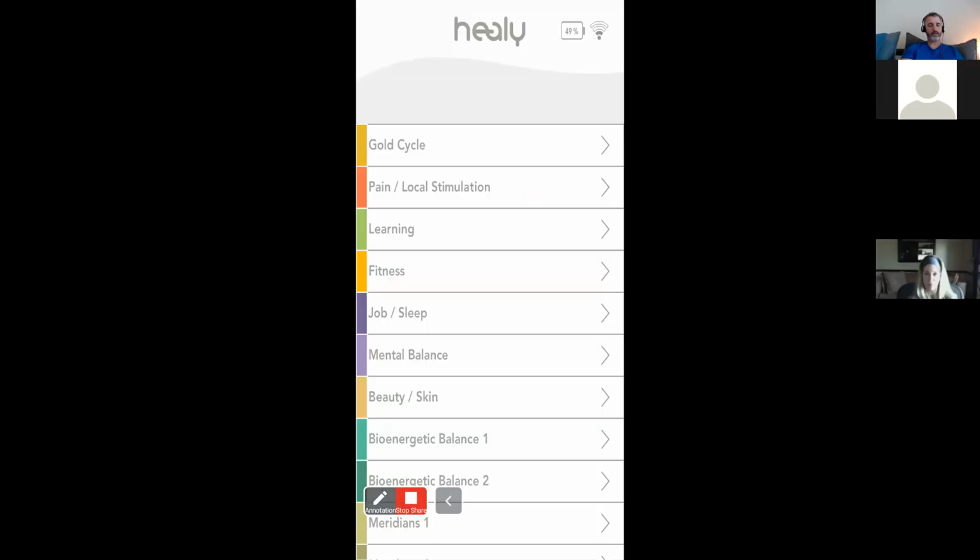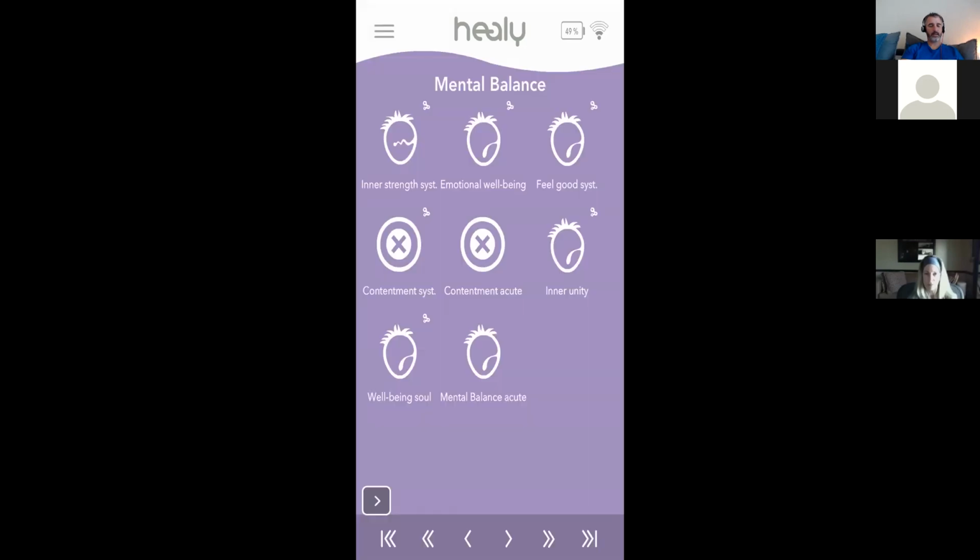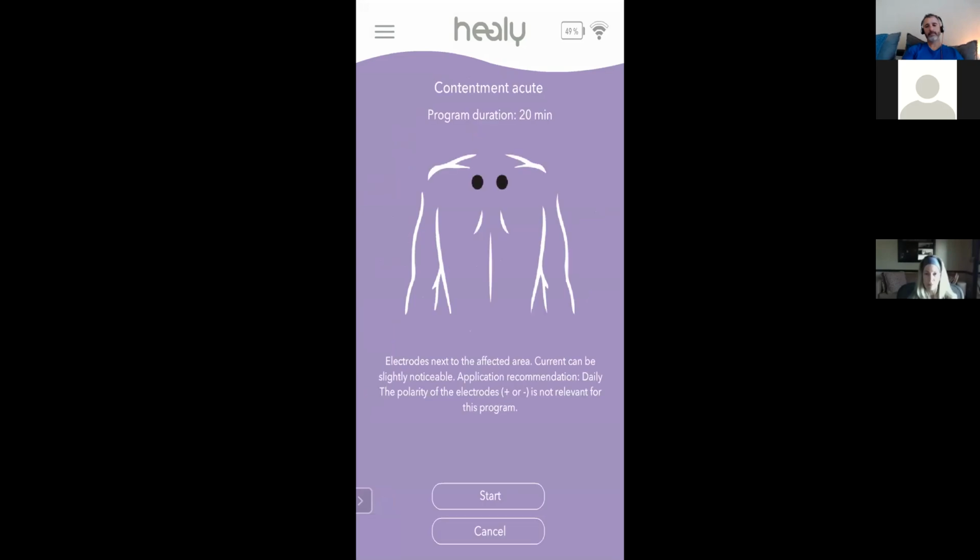So if we go into, for example, mental, okay, and I'm trying to remember which mental program, Contentment Acute, okay. So for example, if I decided to use this program, Contentment Acute, it says, hey, electrodes next to the affected area.